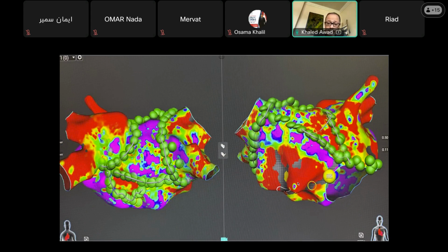So this is idiopathic, never been ablated before. That can happen. Obviously, if you do any linear ablation lesion set, you have to isolate the veins. So this applies to any left atrial flutter. If you have a focal atrial tachycardia and a healthy atrium, it's different. I've had an 18-year-old who had a very incessant focal atrial tachycardia arising from the superior aspect of the mitral annulus, but her atrium was very healthy, and I'm not going to give her a pulmonary vein isolation. It's a focal ablation. We got rid of the tachycardia at the top of the mitral annulus, and that was that.